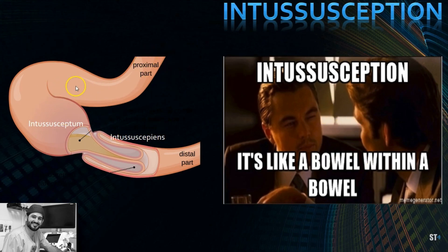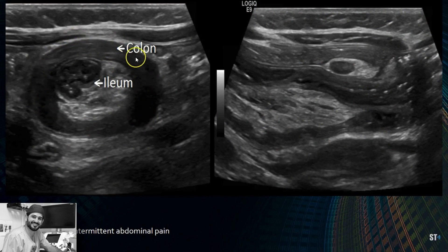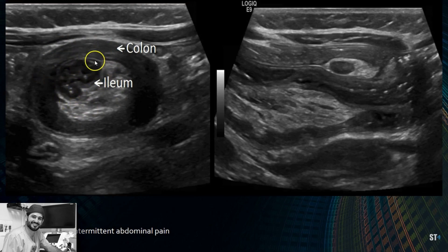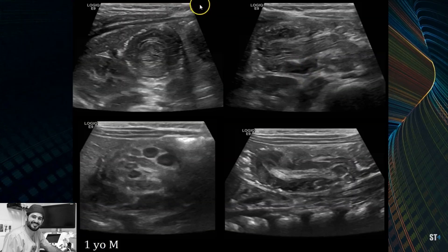The proximal part is called the intussusseptum, and the distal receiving part is called the intussussepiens. In ileocolic intussusception, the ileum is the intussusseptum and the cecum is the intussussepiens. Here's a nice case of a large ileocolic intussusception extending from the right lower quadrant all the way to the right upper quadrant — you can see a thick-walled colon with mesenteric fat and the ileum within it. In longitudinal, you can see the colon wall, the ileum, mesenteric fat, and a lymph node — this is called the pseudo kidney sign because it resembles a kidney with sinus fat and cortex.